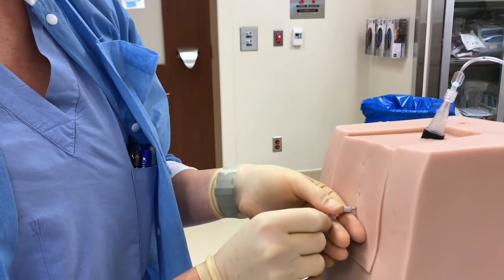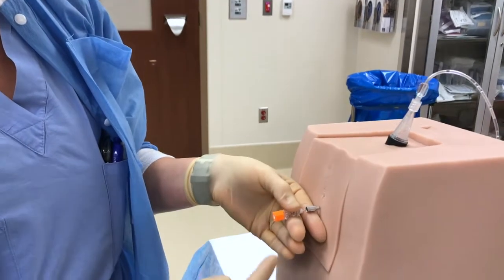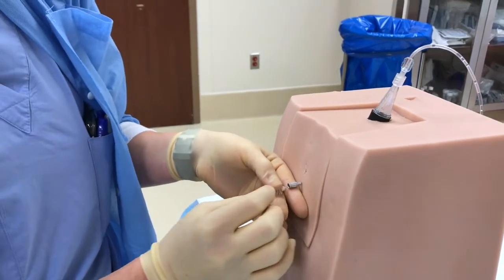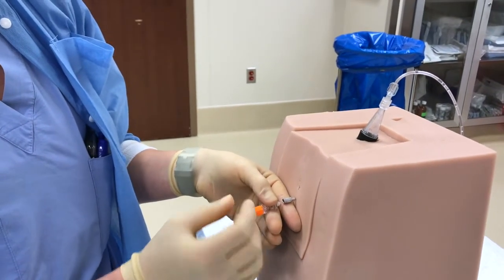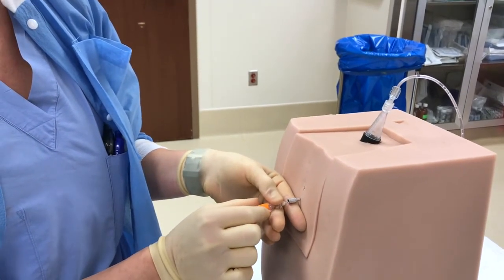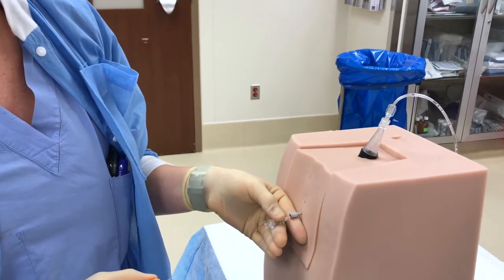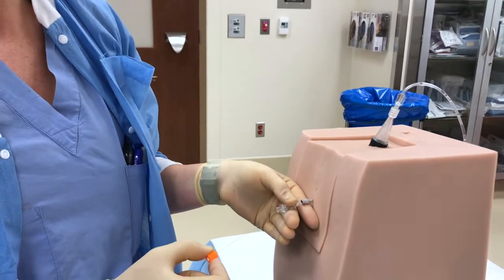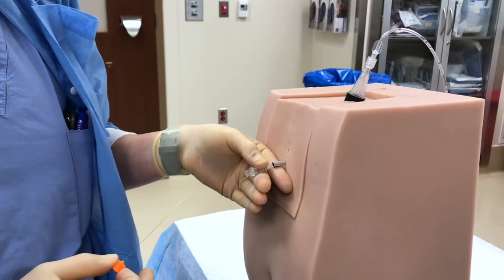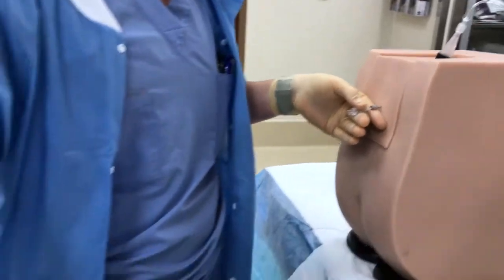And before we take out the stylet, if you can, hold both the introducer needle and the spinal needle in place. The spinal injection can be very fickle, and advancing even slightly, a millimeter forward or back, can potentially lose your location in the space. So carefully hold both the introducer and the spinal needle in place while you remove your stylet and check for CSF. If you are in the correct space, you'll slowly see CSF start to return out of your spinal needle.